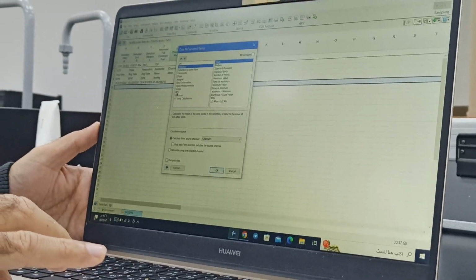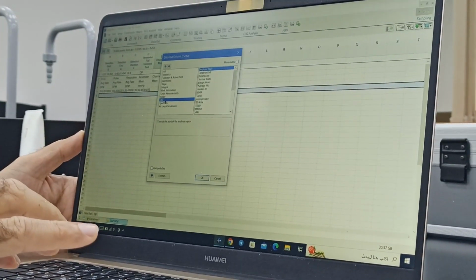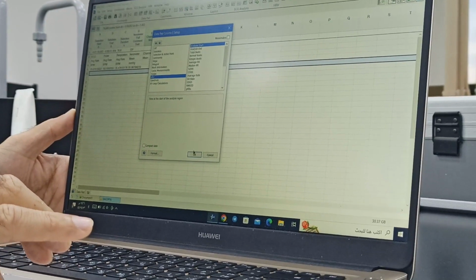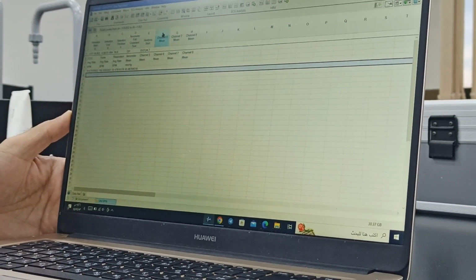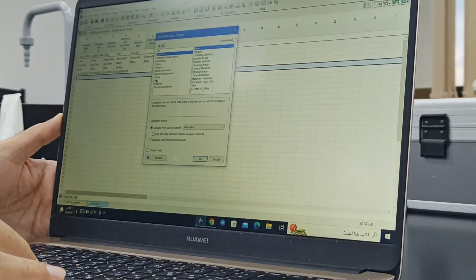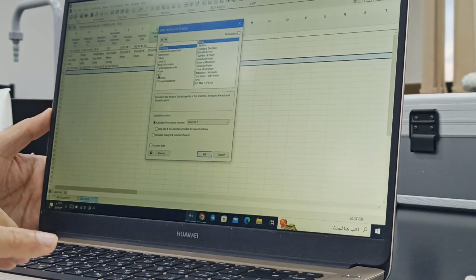Then from here onwards we can have actual HRV parameters. So we press HRV and now there are so many things there. It itself is giving the analysis start. So we'll give this one as number one, and start of the analysis. We might delete the ones which we have done in the beginning, this selection start. Analysis start. Then go to HRV again, and analysis end. Then we go to HRV again, the whole thing.